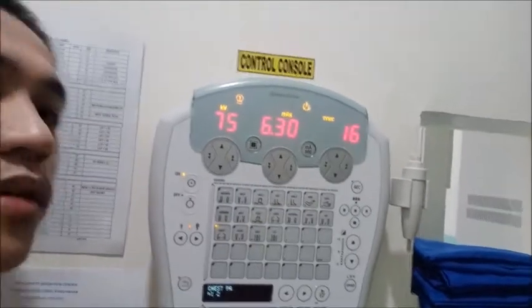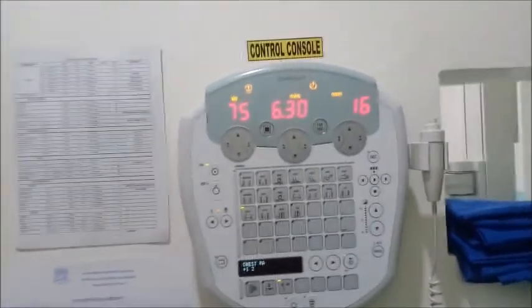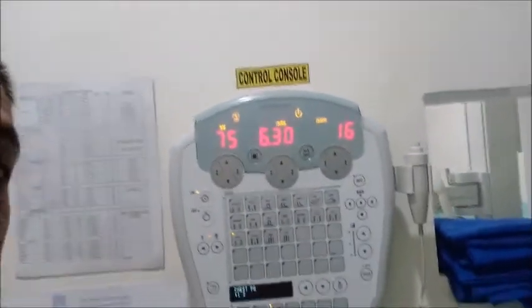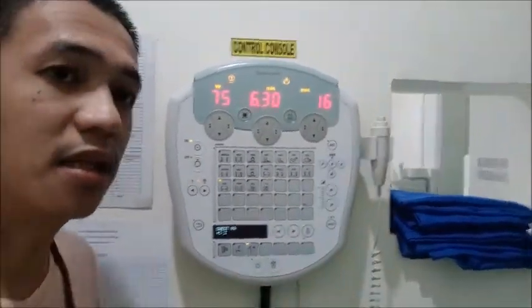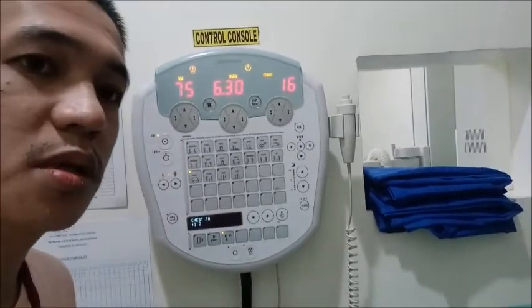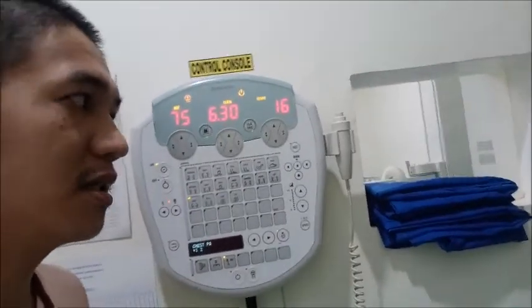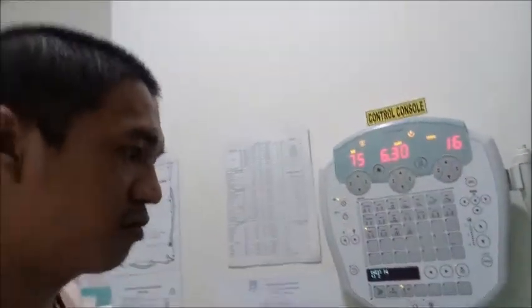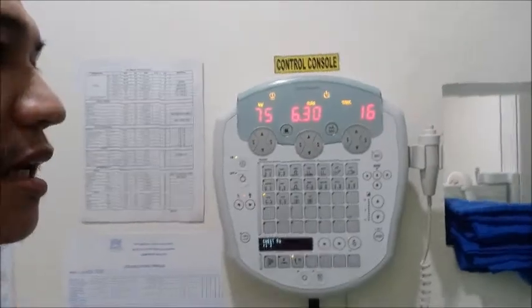Okay, for my body build, we'll use 75 and then 6.3. So that's how you set up your exposure for the chest exam. Okay, since in this case I am the first patient, or the first to use the X-ray tube for the day, then of course we have to warm up the tube. Go back to your technique, the factors are around 12 mA, and then 70, 80, 90 kVp. So you can warm up your X-ray tube before you expose the patient.